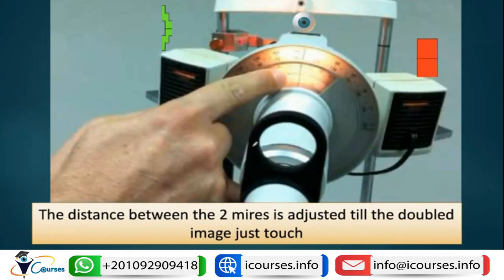Again, this is the keratometer, and we are looking from here. This is one mire, this is the other mire, and this is the eye of the patient. This mire will project a green staircase over the surface of the cornea. This mire will project a red square or red rectangle over the surface of the cornea. Through the joystick, we can control the distance between both of them. This distance is what adjusts the adjustable object size, and by changing it, this will change the keratometric reading and the radius of curvature.